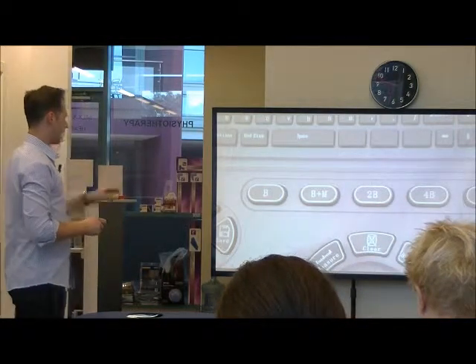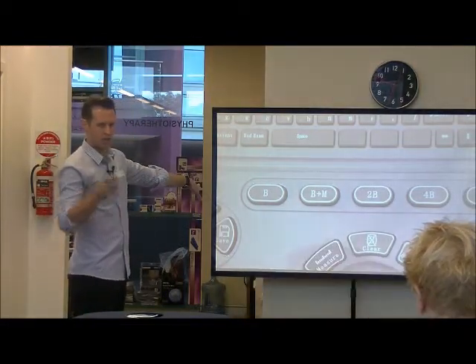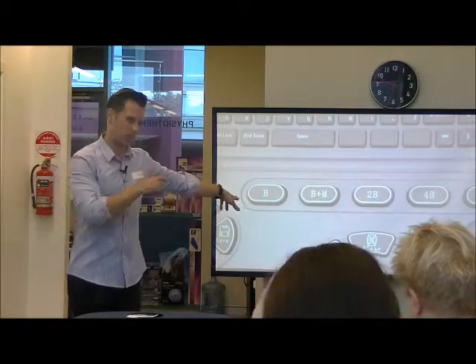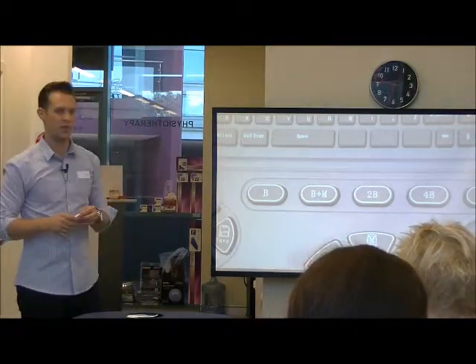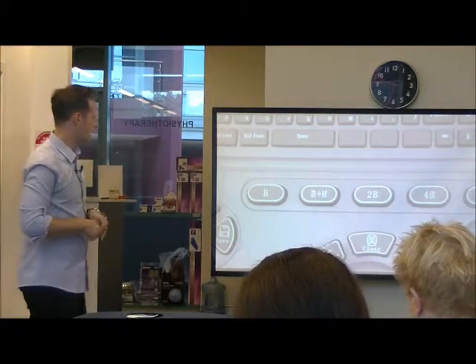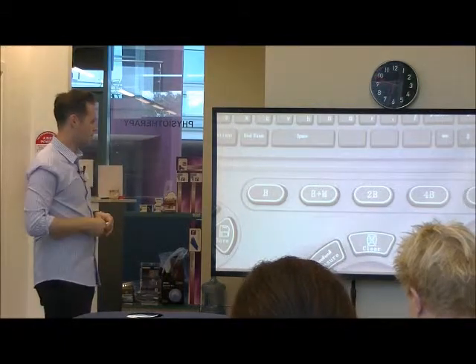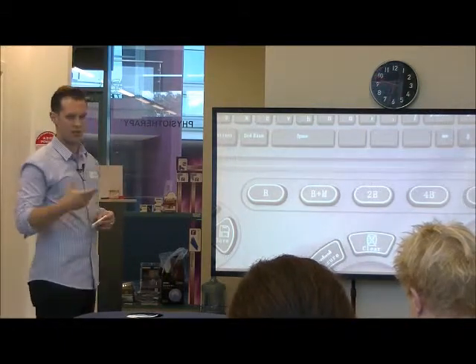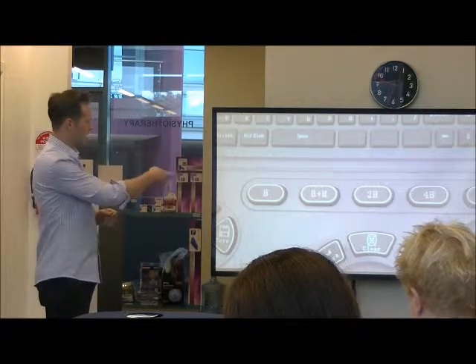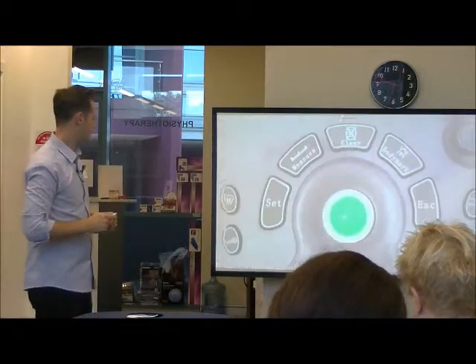In terms of the modes, B mode stands for brightness mode, and that's the standard image in real-time ultrasound that we're used to seeing. B plus M we're going to use for its brightness plus movement, and we're going to use that for the diaphragm later, so we can see the movement of the diaphragm while we're doing some real-time ultrasound. And that, I think, is very interesting, but also gives the patient some feedback about the smoothness of the contraction, the length of the contraction, and the amplitude of the contraction also. And then 2B and 4B are just side by side B mode images.